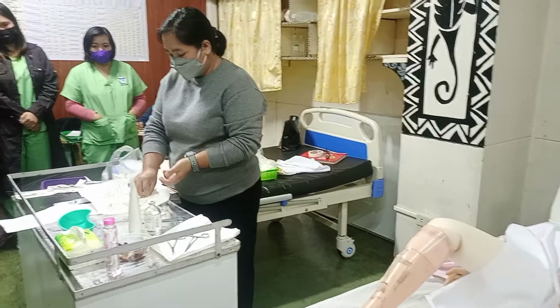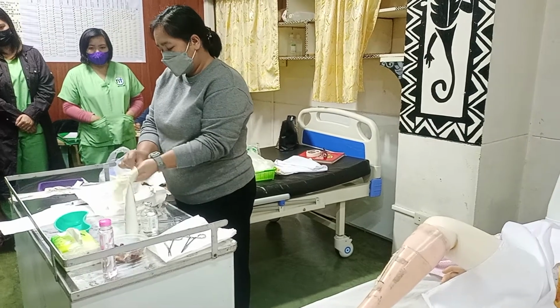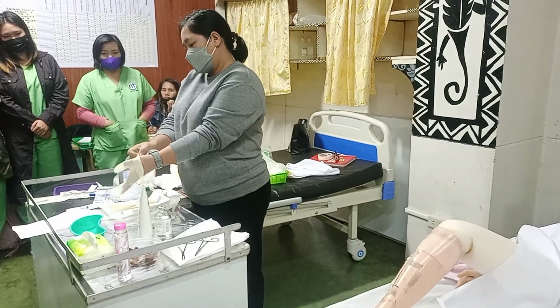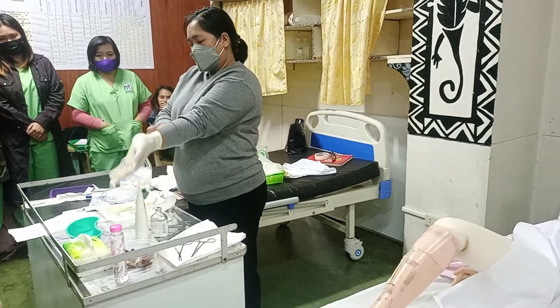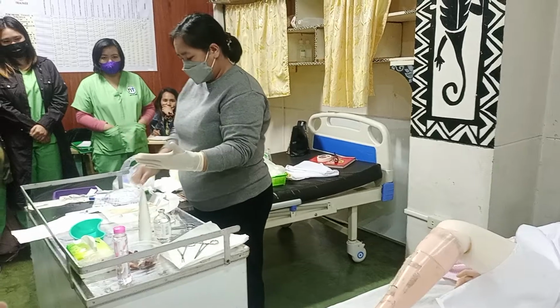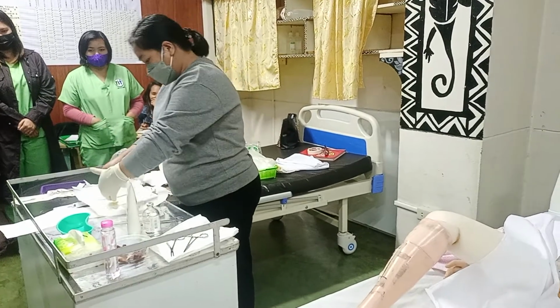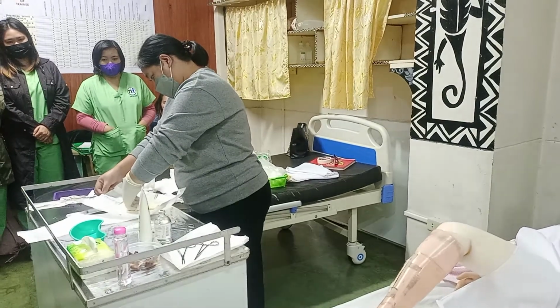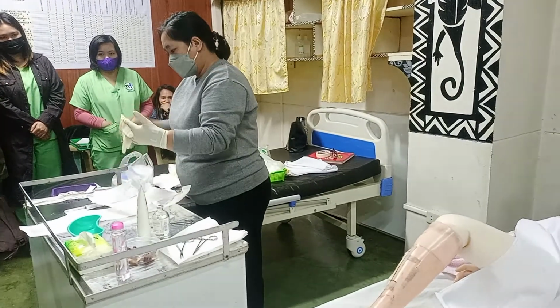Skin to skin, gloves to gloves. Thumbs away. Oh, kita.